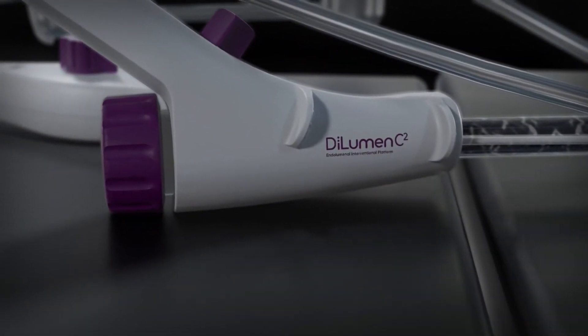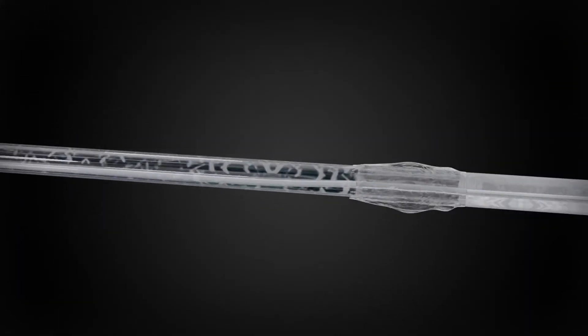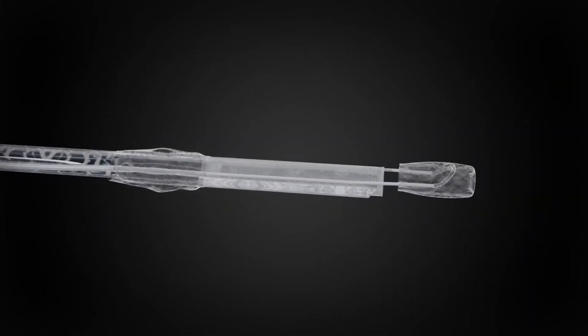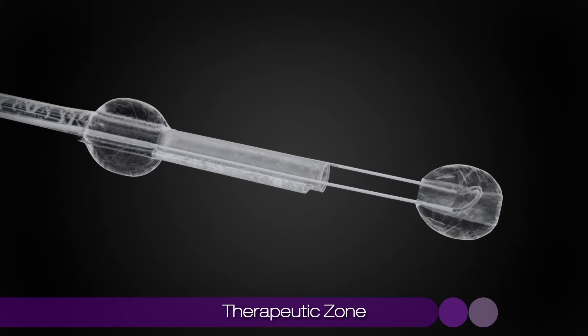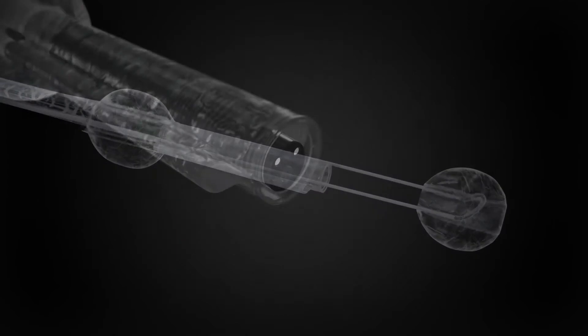The Lumendi Dilumen C2 is an endoscope accessory consisting of a dynamic dual balloon system that creates a therapeutic zone to enhance visualization, diagnosis, and endoscopic treatment.